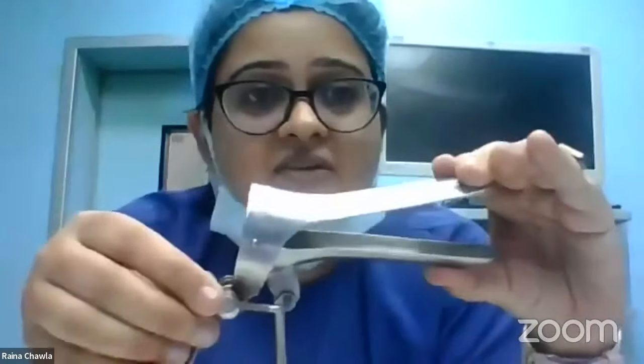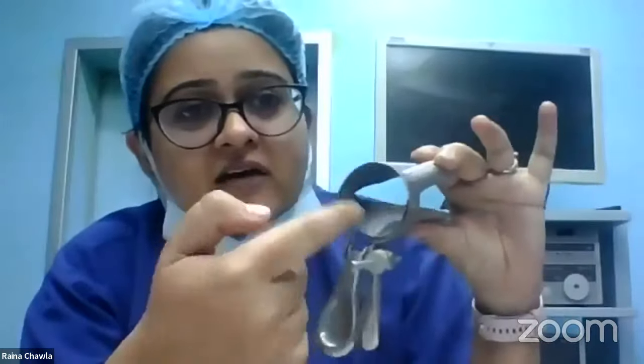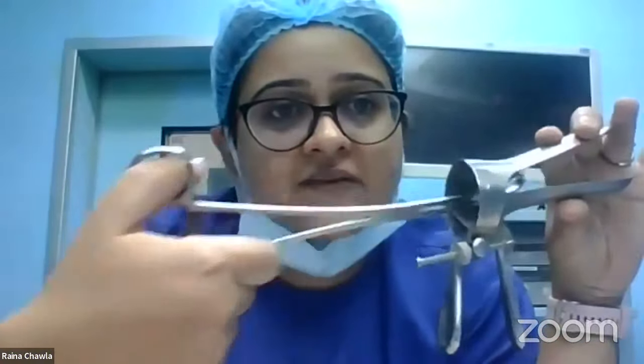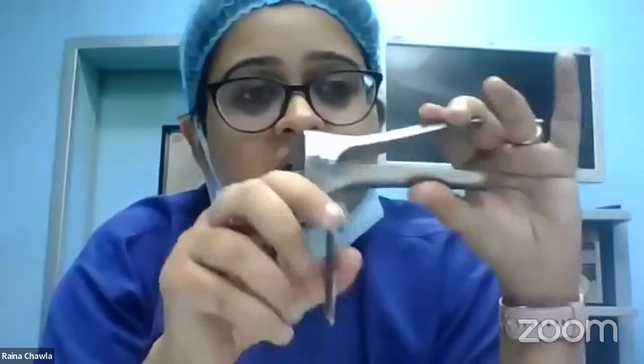What are the disadvantages of a Cusco's? The disadvantage is that the space is restricted. You can see, once I've opened up the Cusco's, I have only this much space. In this space, I can put maybe only one instrument. It leaves me with very little maneuverability, very little space to do procedures.